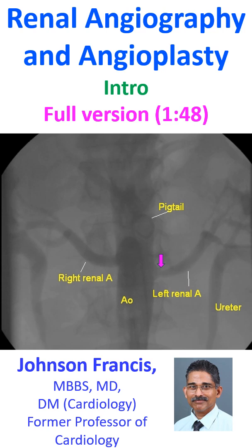It may be better to do selective angiograms after locating the renal arteries by non-selective aortogram, as in this case. This will help to identify multiple renal arteries if present.